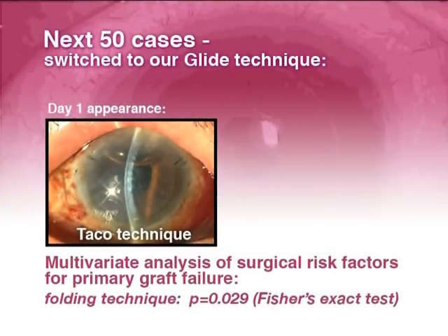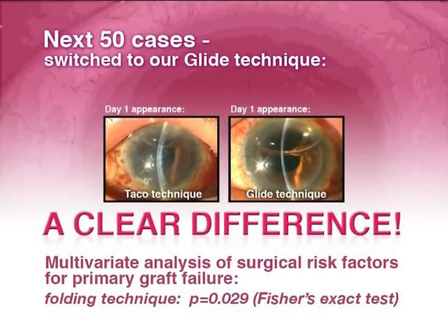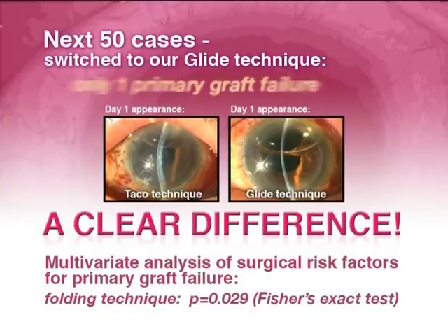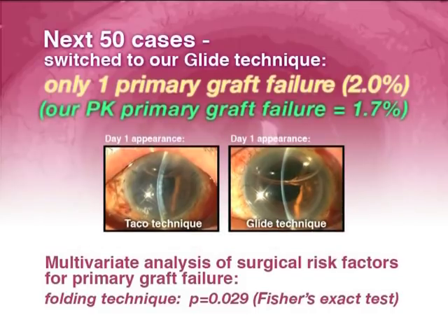Our corneas in the folding cases were routinely edematous on the first day, while our glide cases were almost always clear from day one. To date, we have only experienced 1 primary failure among our 50 glide cases, representing a much lower primary failure rate of only 2%, much closer to the primary graft failure rate of 1.7% for penetrating keratoplasty at our center. In addition, our 1 failure was our first attempt at the glide technique, in which we inserted an overly thick 400 micron donor, which resulted in Descemet detachment.